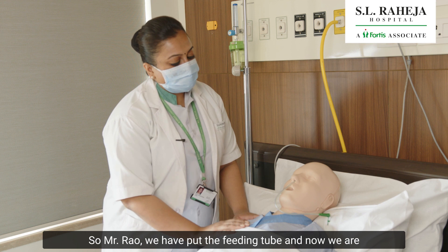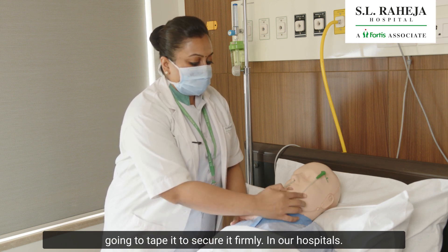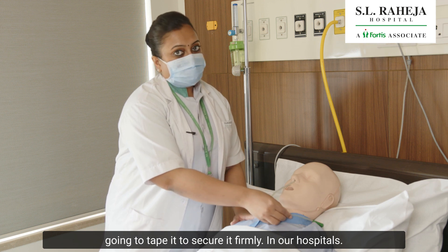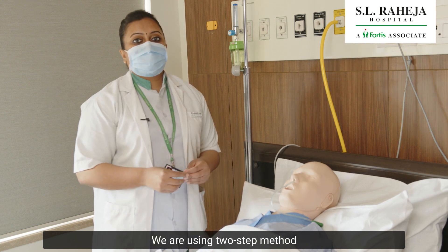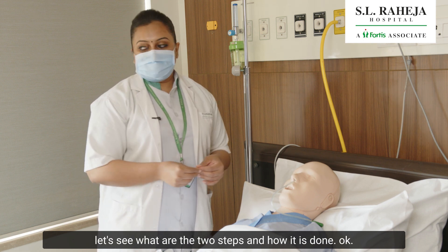So Mr. Rao, we have put the feeding tube and now we are going to tape it to secure it firmly. In our hospital, we are using the two-step method for securing the feeding tube. Let's see what the two steps are and how it is done.